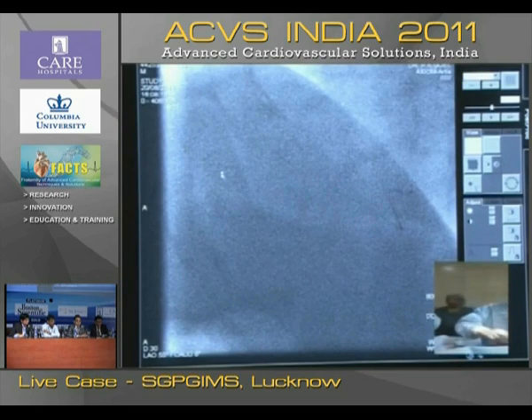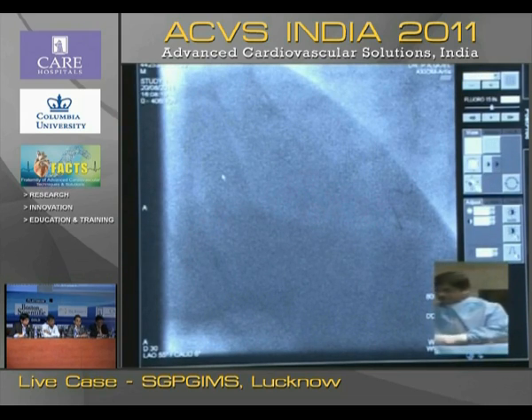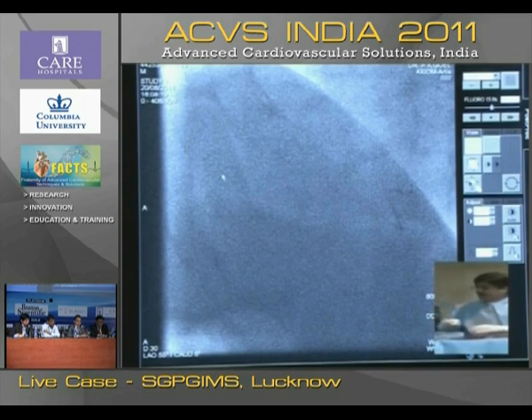Okay. Now get me a 2.5 regular from here. 2.5 balloon. Okay. Now we can see the angiogram.